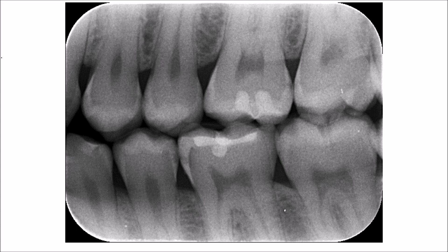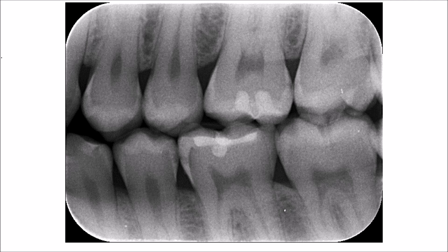Having a closer look at the area medial to the dentino-enamel junction, you will see another radiolucency just below the dentino-enamel junction. This represents dentine caries. Dentine caries always have a U-shaped radiolucency, where the open side of the U is towards the dentino-enamel junction and the base of the U is towards the pulp, following the direction of the dentinal tubules.